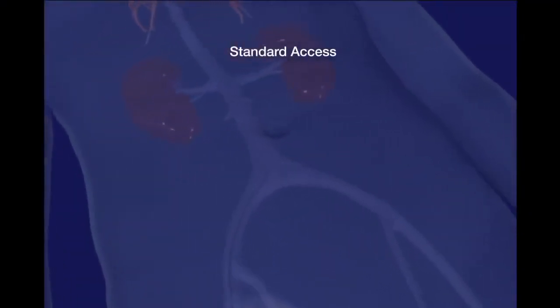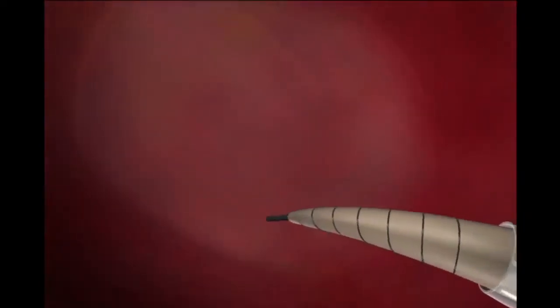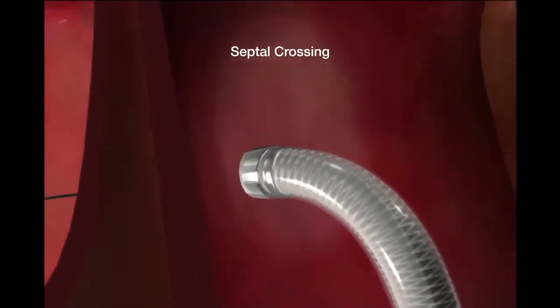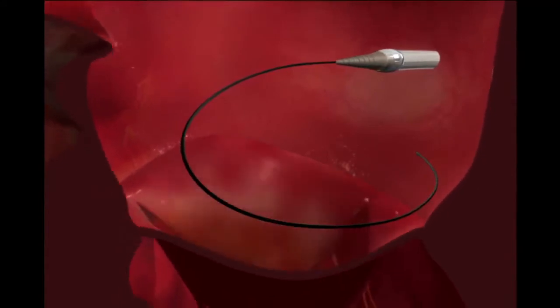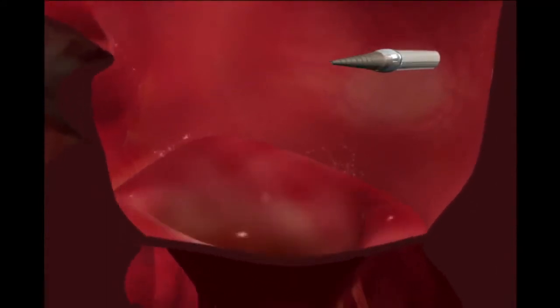The catheter is introduced over a guide wire that has been placed using standard techniques. The dilator is used to gradually advance the guide into the left atrium. The guide wire and dilator are removed.